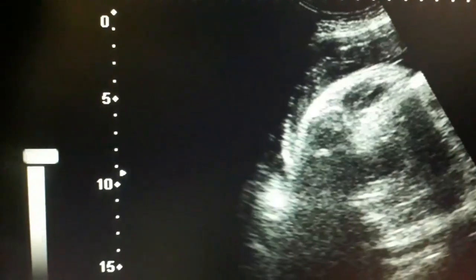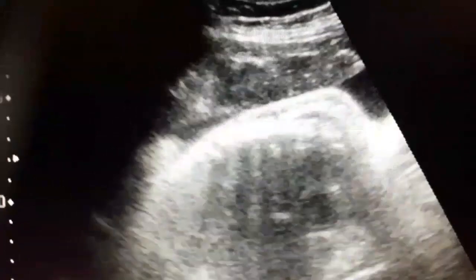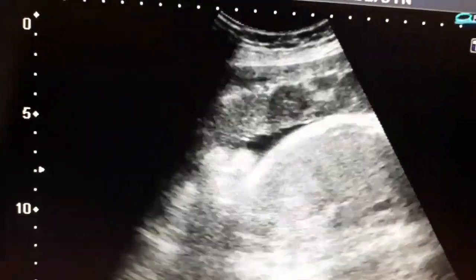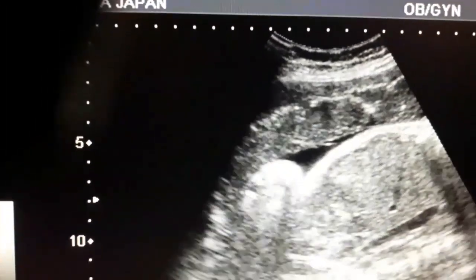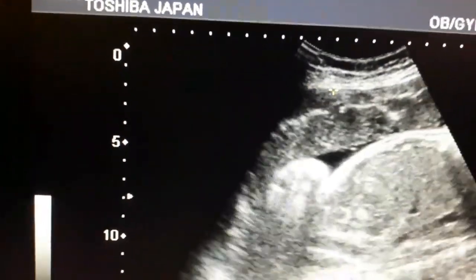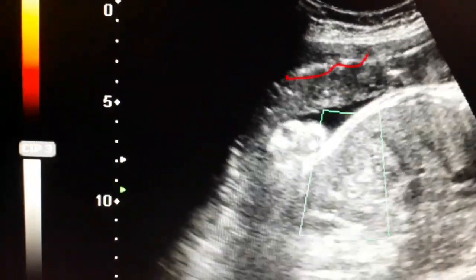You are also appreciating the placenta — its fundal end — and you can appreciate the maturity of the placenta from this close-up view. The grade 1 placenta shows dot-like whitish structures. The grade 2 placenta shows whitish lines, and the grade 3 placenta is the placenta that has lines and sinuses.